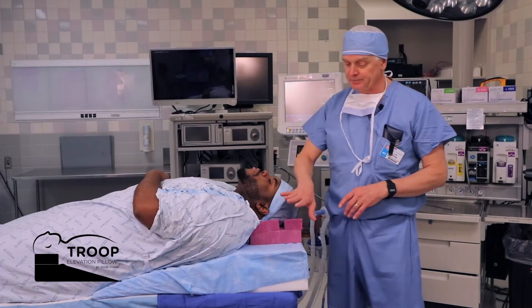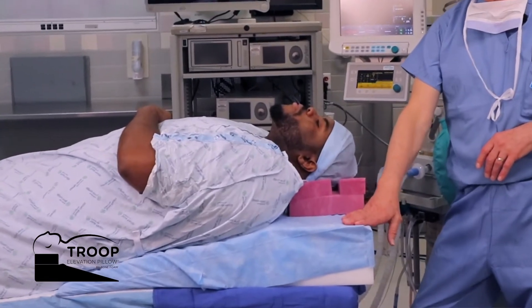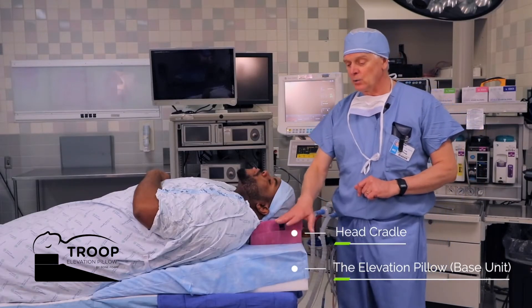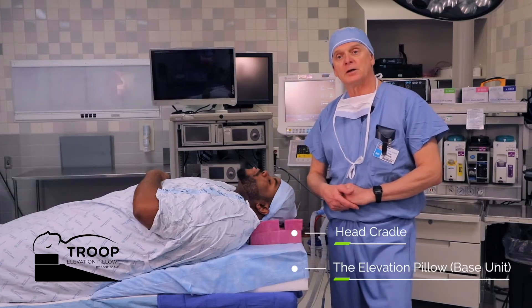This is known as the two set. The base unit, which is the Troop Elevation Pillow, and the head cradle — it must be used with a head cradle, any kind of head cradle — which is placed on the flat upper plateau or flat upper part of the Elevation Pillow.